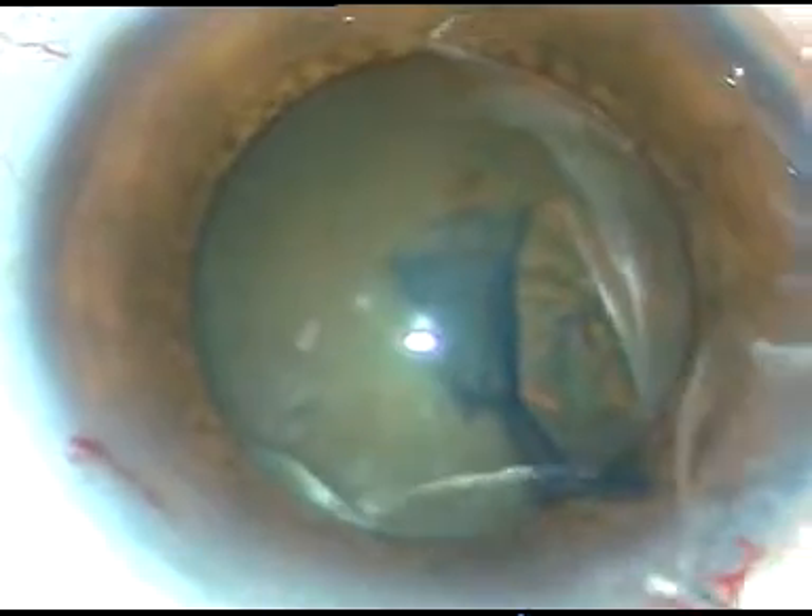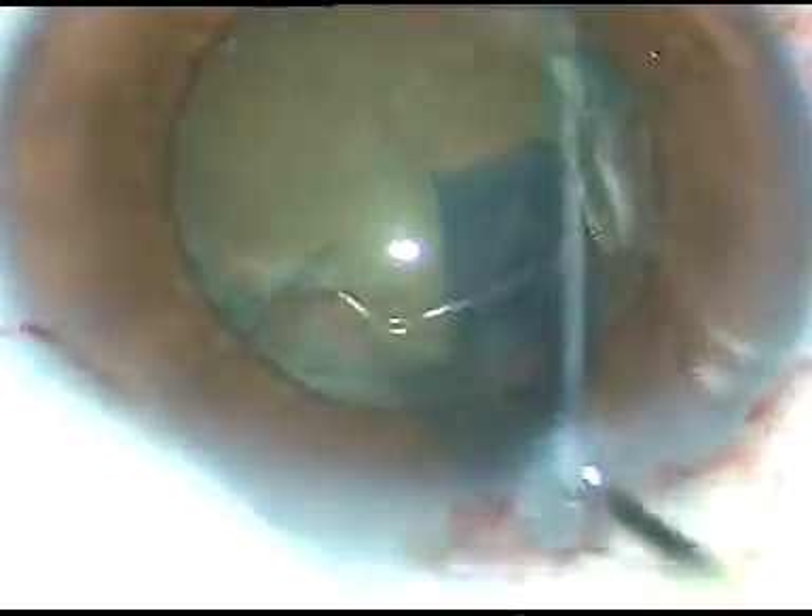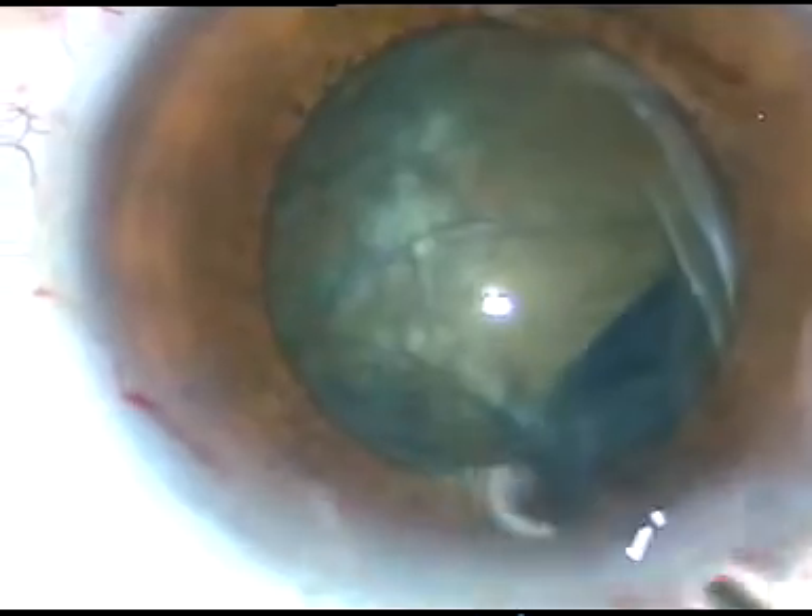Now I am going to do hydrodissection. See what happens — as I do hydrodissection and I decompress the nucleus, some fluid comes out, intraocular pressure becomes less, and the pupil starts becoming smaller.